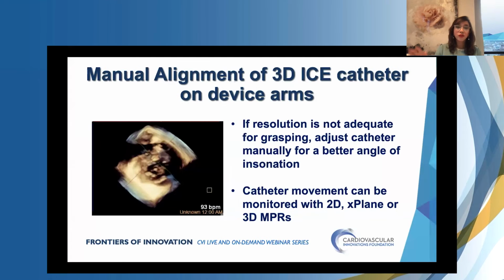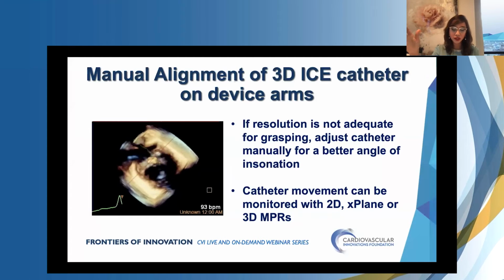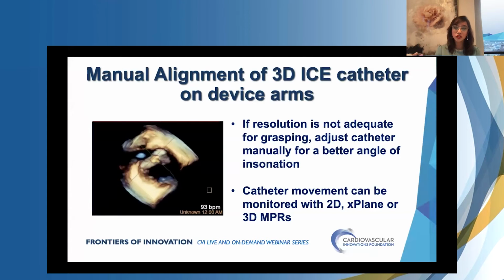Before I wrap up and hand it over to Lynne, here is the most important use case of 3D navigation. What I mean is, as I mentioned earlier, to manually align your high resolution planes over the device arms, as you can see on the left-hand side, to optimize our grasping view. This technique is best explained by a visual demonstration, and I'm going to hand it over to my one and only Lynne Brown from Philips, who's giving you a live demo, highlighting the steps.